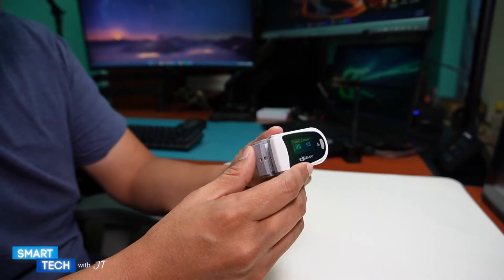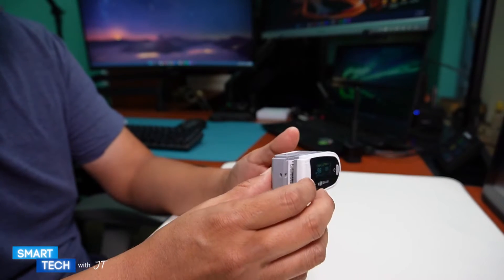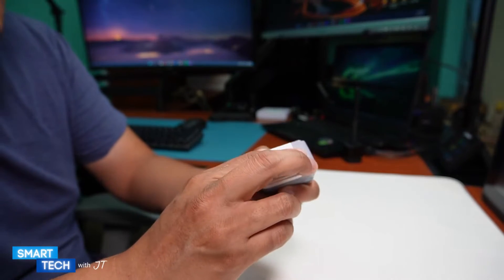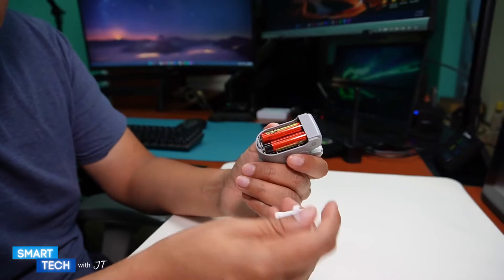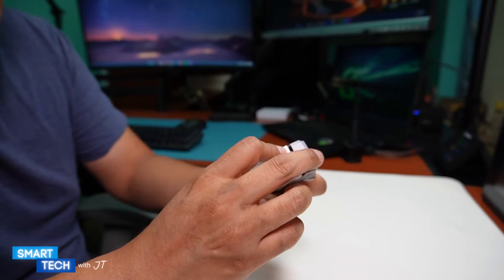The battery life is really good. I've had this for around eight months and the batteries it came with — as shown in my other video — are still the same batteries I'm using. So it should last you a while.